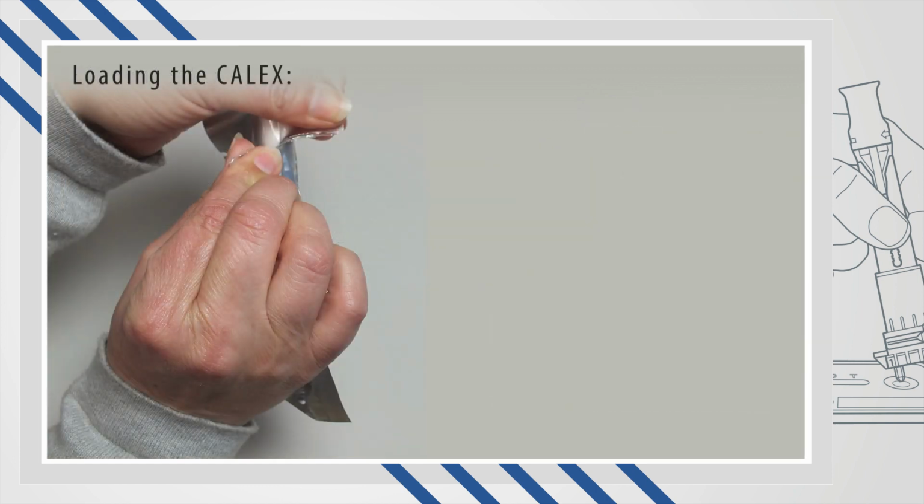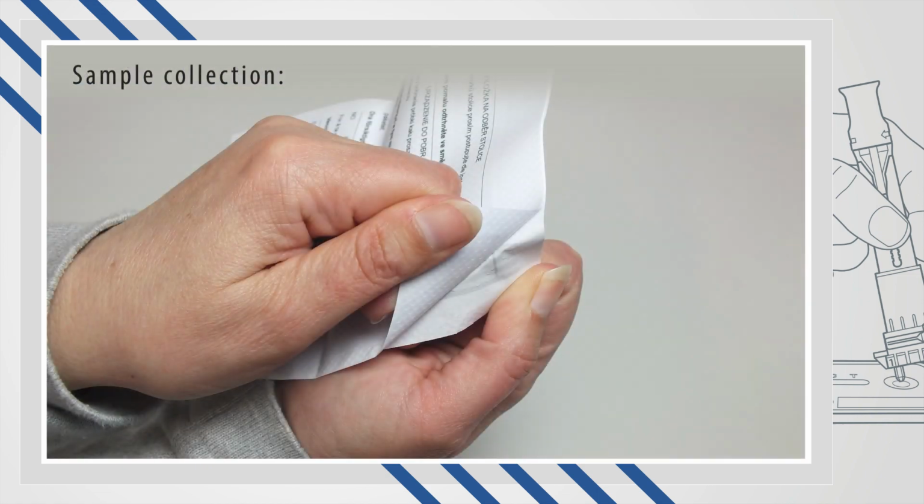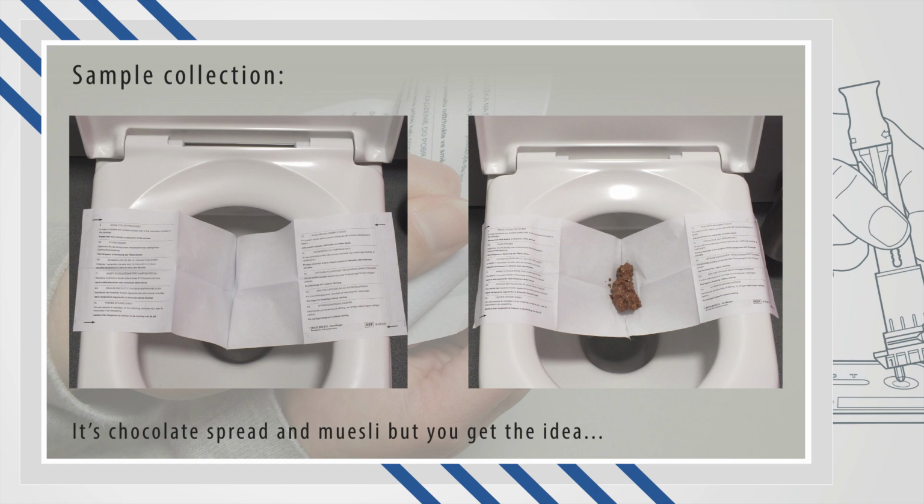Remove the CALEX valve extraction device from the foil pouch labelled CALEX. Use the small slits in the side of the pouch to assist with opening. Carefully open the collection paper by peeling from the corners. Attach the paper towards the back of the toilet seat using the adhesive strips on the sides of the paper.